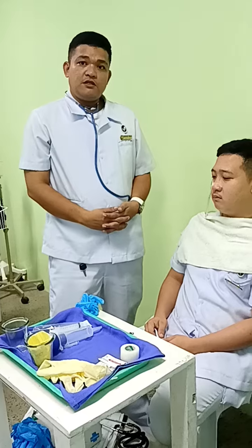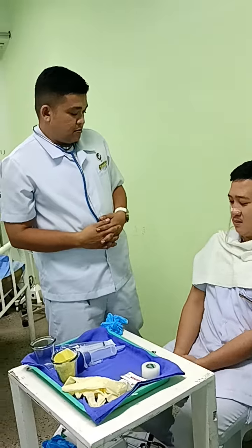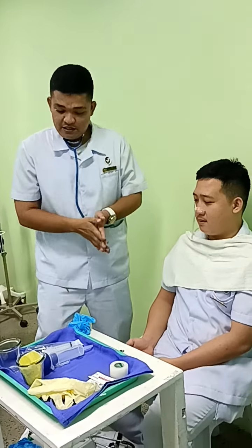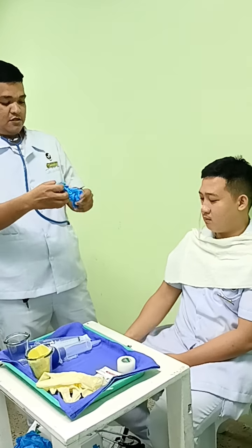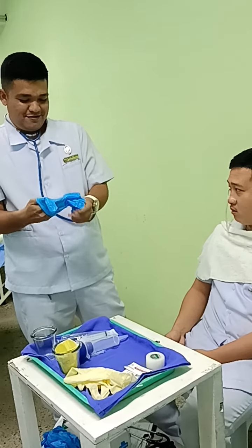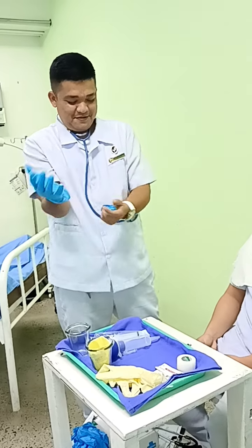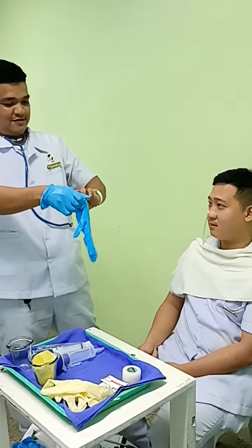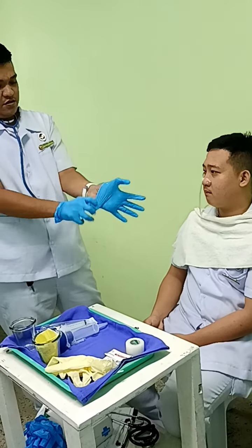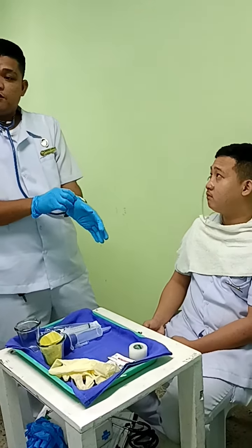And we also document the procedure. So first is to check the tube placement. But before checking the tube placement, we have to wash our hands first and we have to don our gloves. Since the tube is already used, we have to check for any residues.